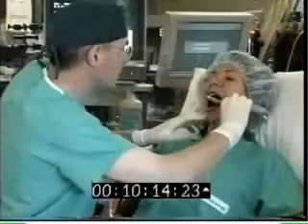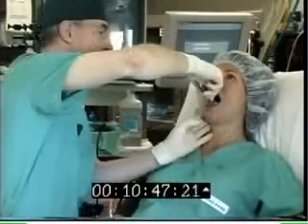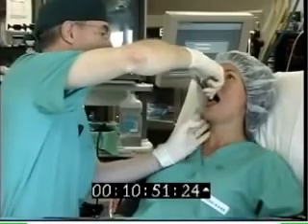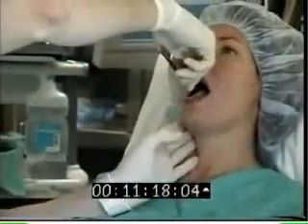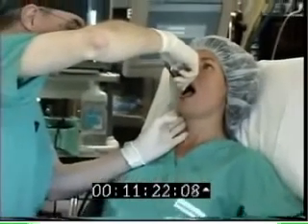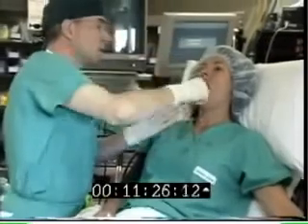The intensity of the block can be supplemented with superior laryngeal nerve blocking using Jackson crossover forceps holding a cotton pledget soaked with 4% lidocaine solution. The tip of the forceps is placed at each piriform fossa for approximately 60 seconds. This will provide intense block of the superior laryngeal nerve.